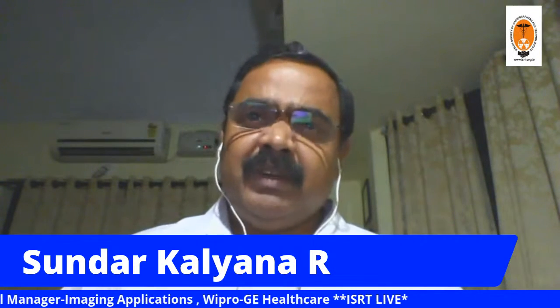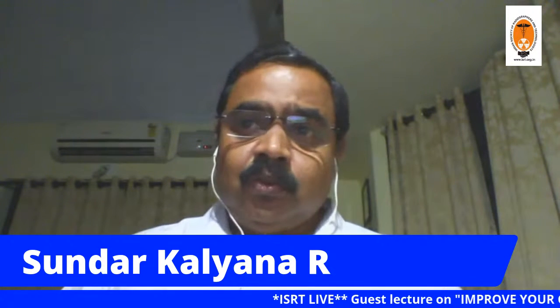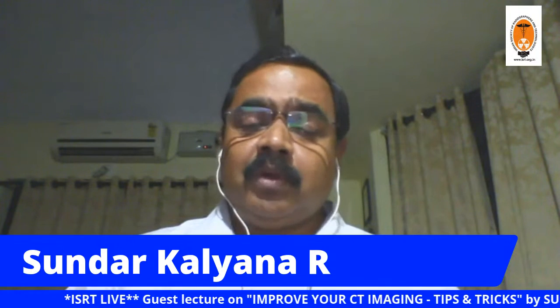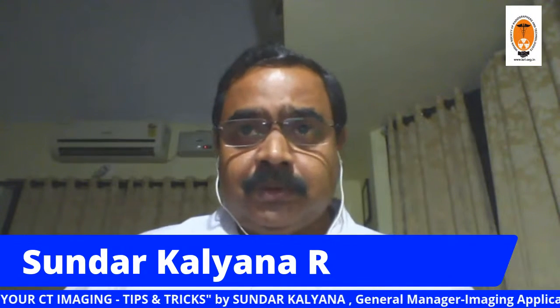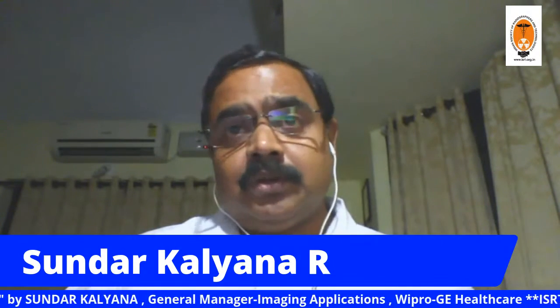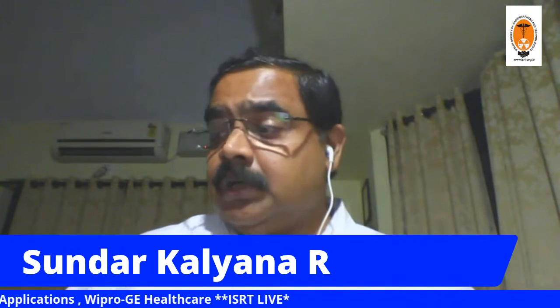So it's a combination of what the purpose is. That's why I always say check the clinical task before you select a protocol. Check with the radiologist, check with the referring doctor who can throw more light on the clinical requirement, what they are looking for from the scan and the result they are expecting. So once you know that clearly, then it's up to you to use the right lowest possible kVp, the smallest possible scan field of view, and of course use iterative reconstruction as much as possible. Okay, as high a percentage as possible.